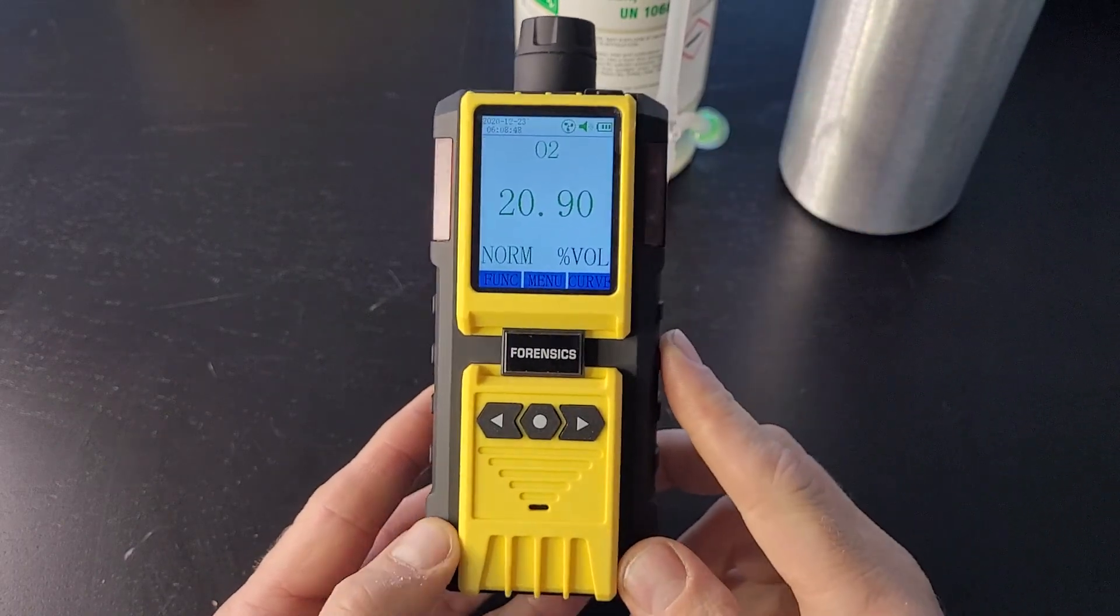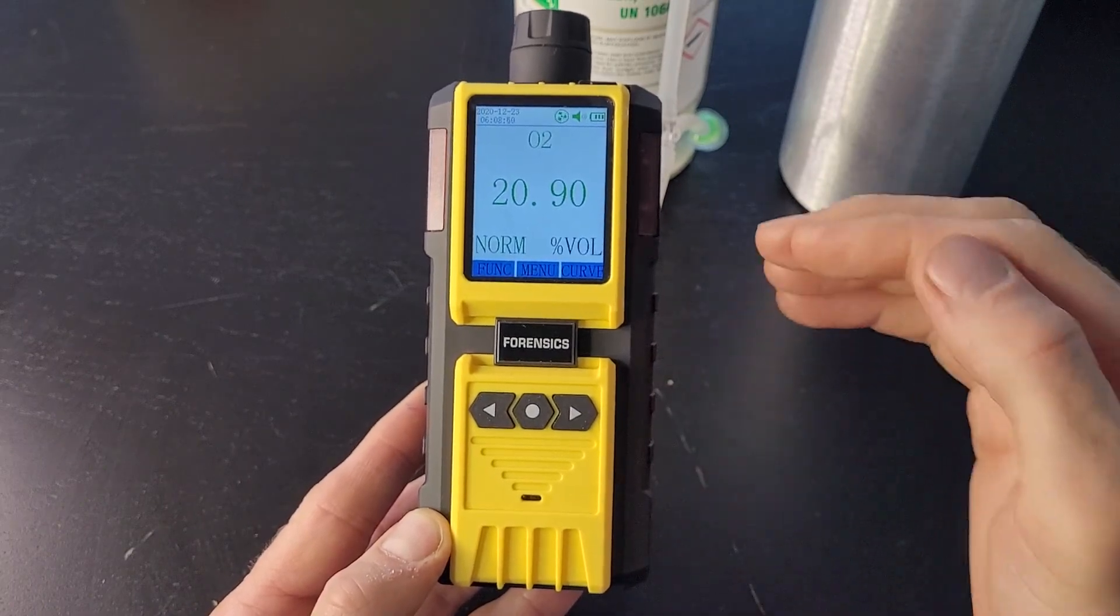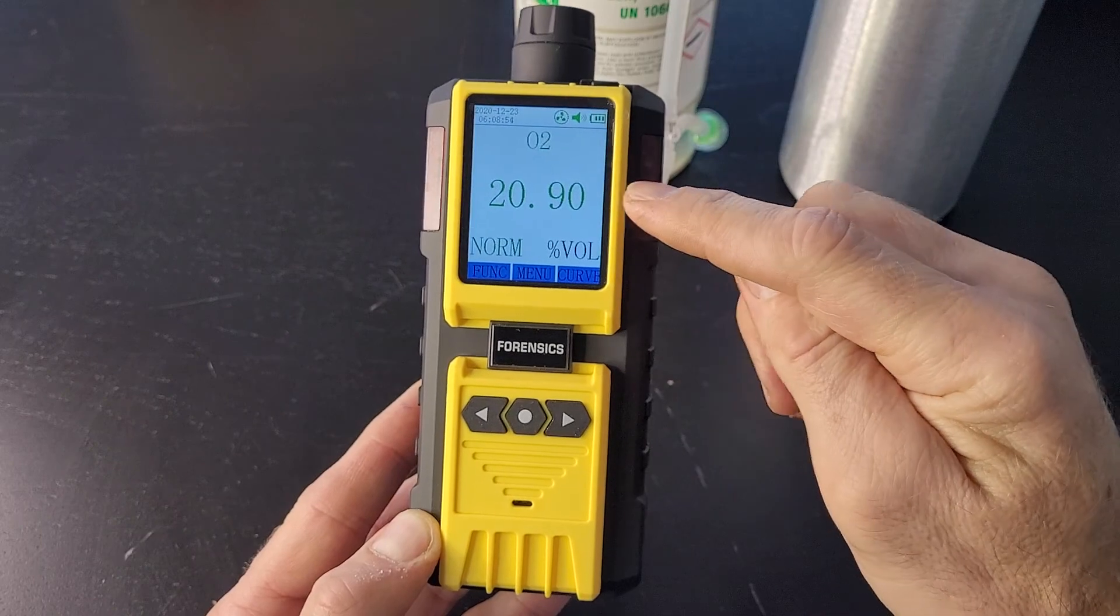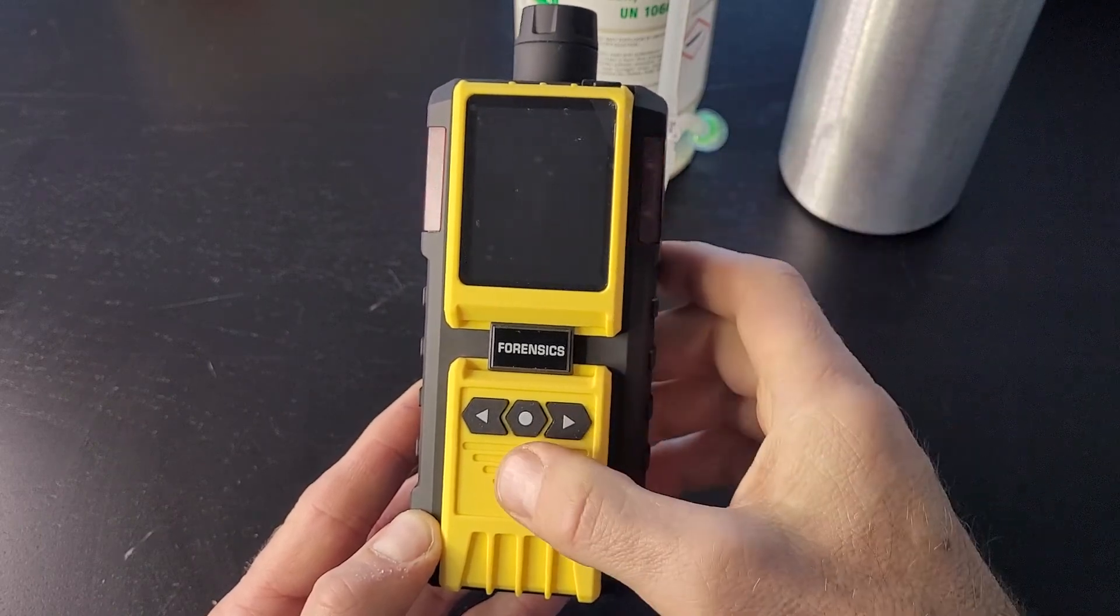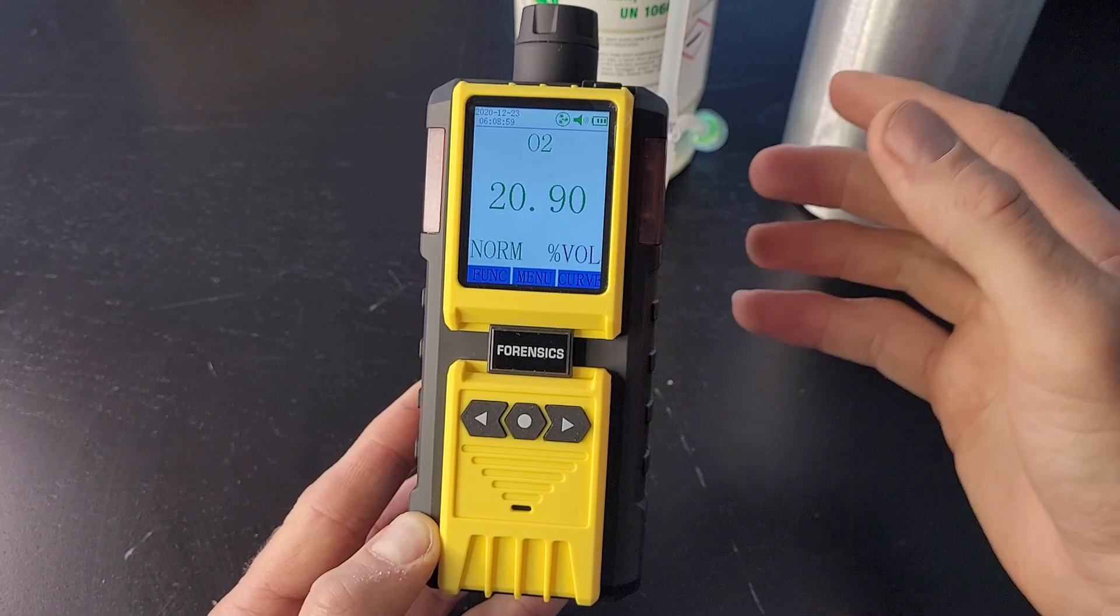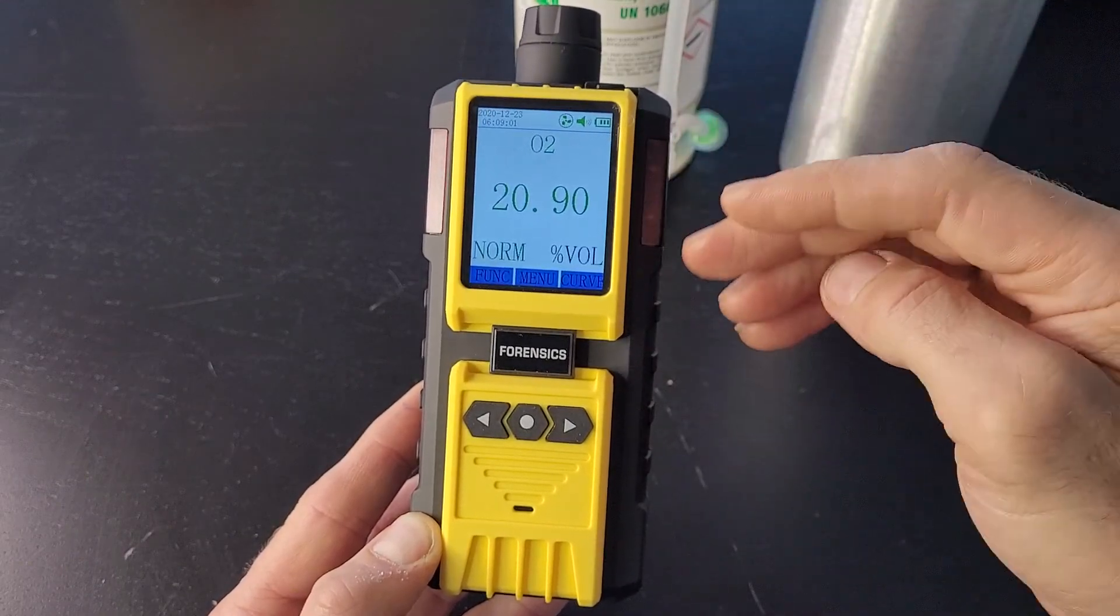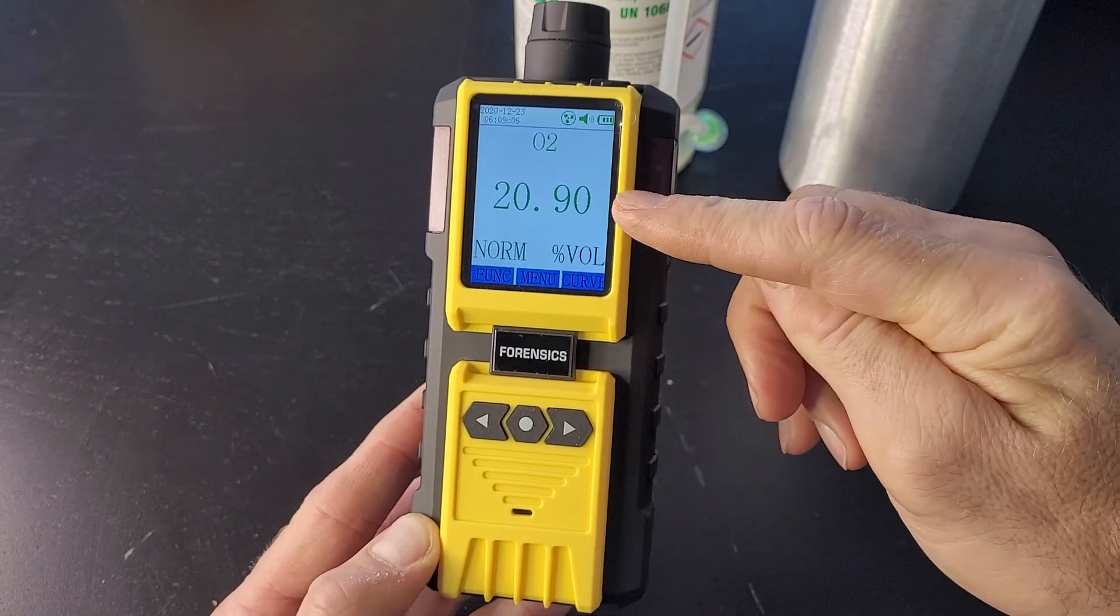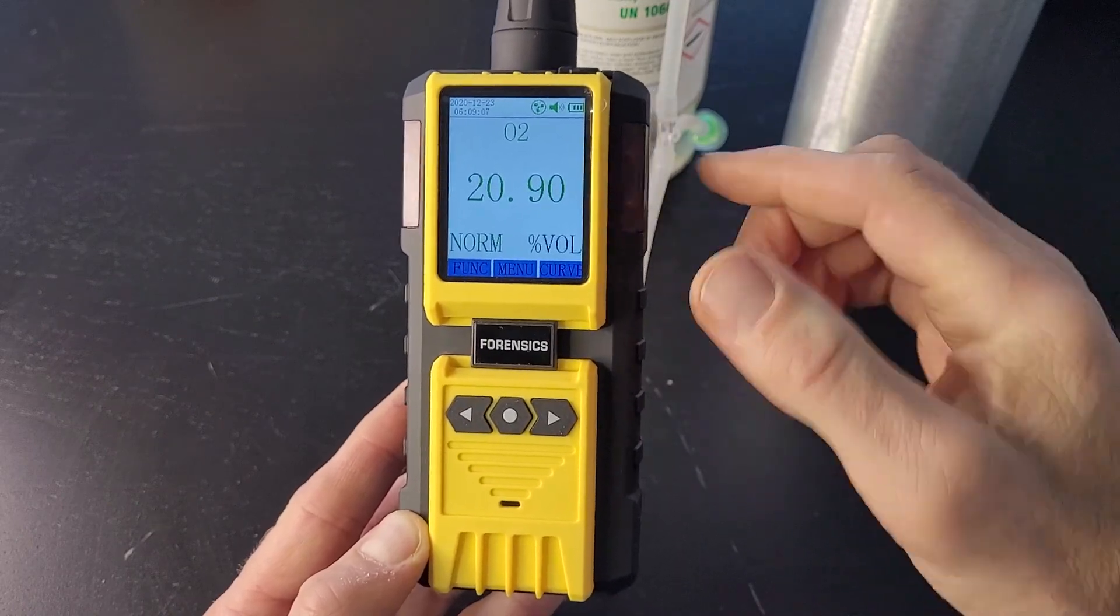There's two parts to this video. One is a quick calibration to 20.9%. Sometimes the 20.9 wavers, it could go down. It could be 20.6, 20.3, or it could be above, 21.1. You want to always get it at a starting point of 20.9. How do we do that?